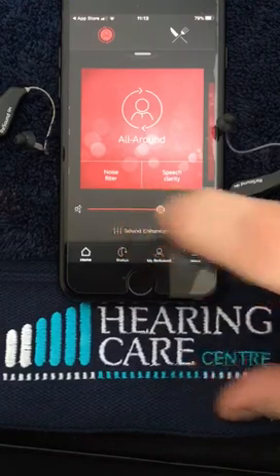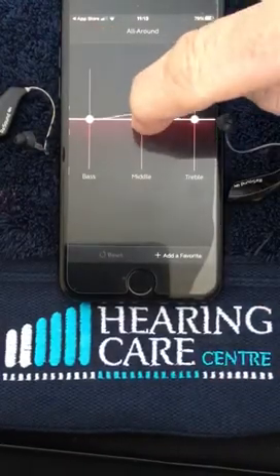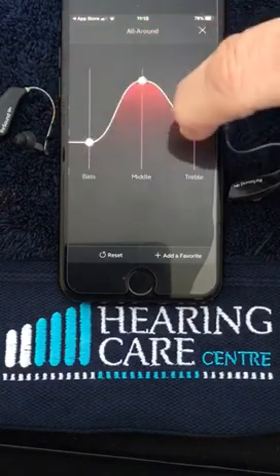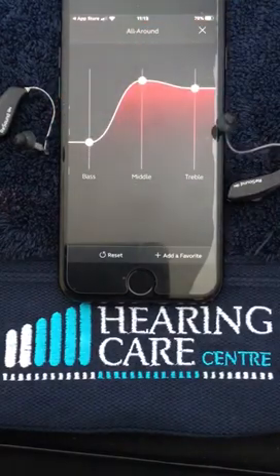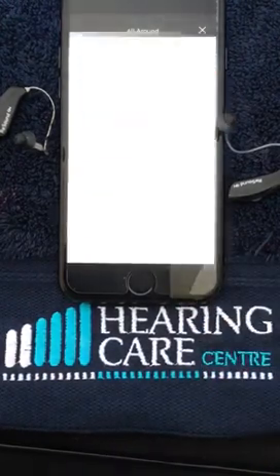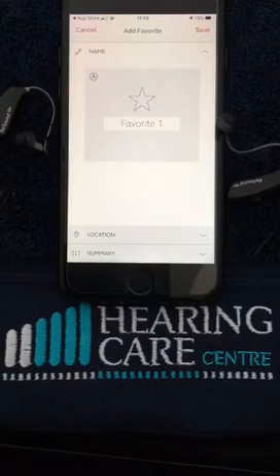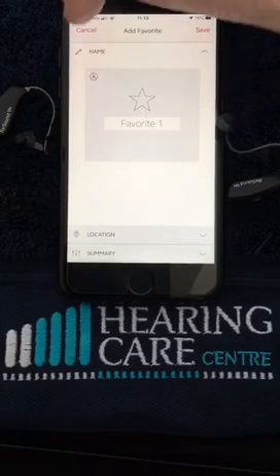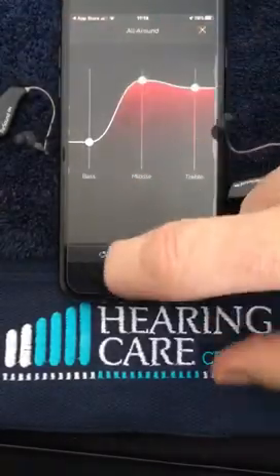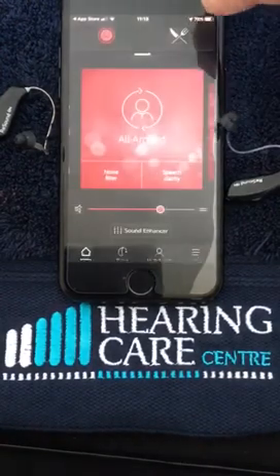We've also got a Sound Enhancer here, so you're able to set the level of the hearing aid to your own situations. If you're in a difficult meeting you can preset them and add it as a favourite — type in what you want, what the meeting is, so when you go back there the following week or month it's already saved into your phone. We can reset it to go back to normal, then close that down at the top.